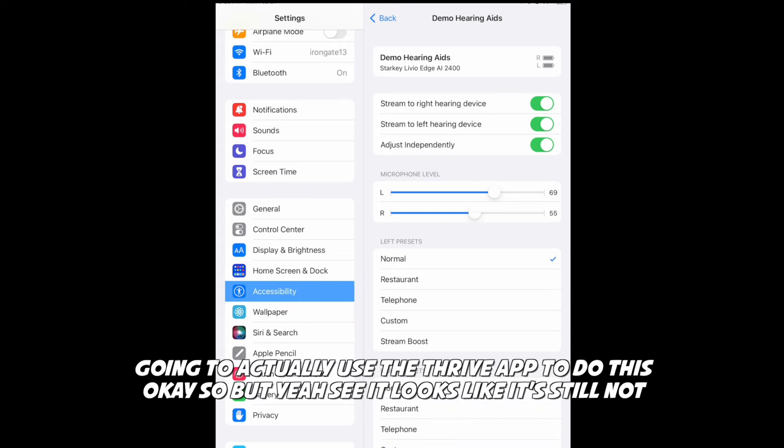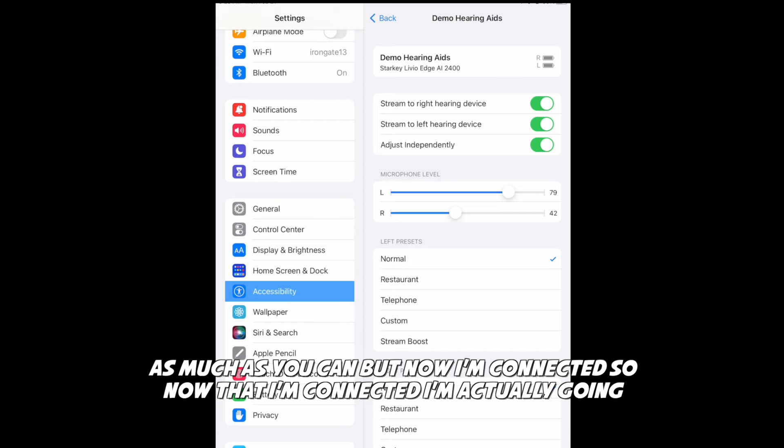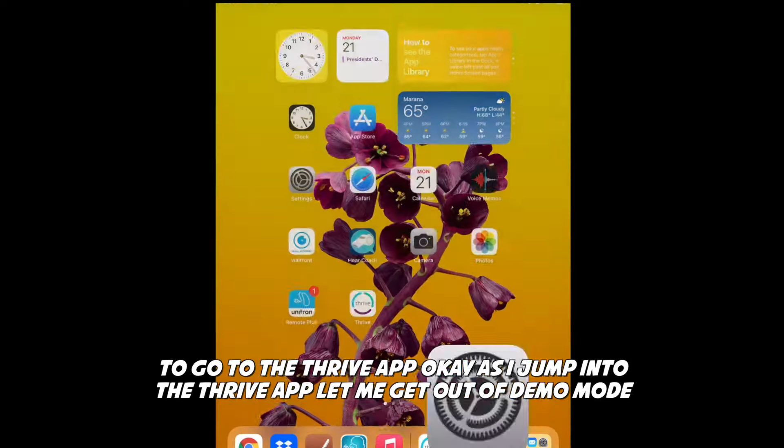It looks like it's still changing them both at the same time, so try not to touch these buttons as much as you can. Now that I'm connected, I'm actually going to go to the Thrive app.